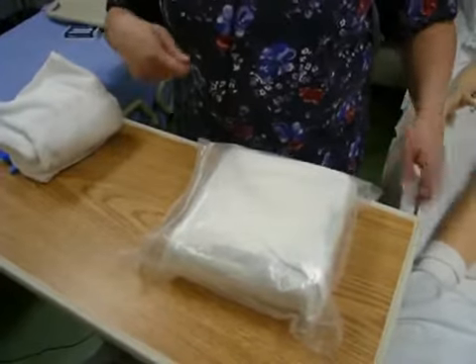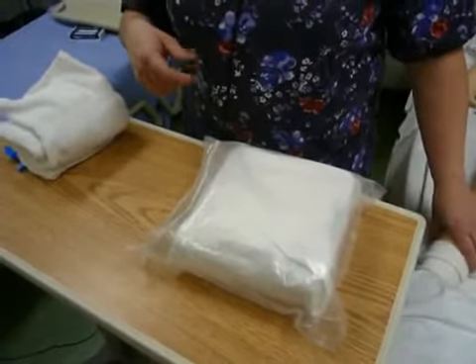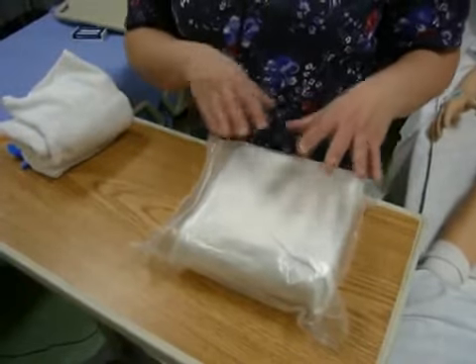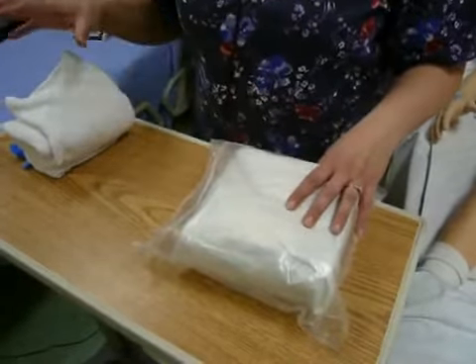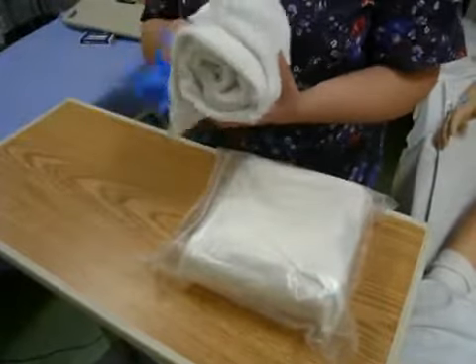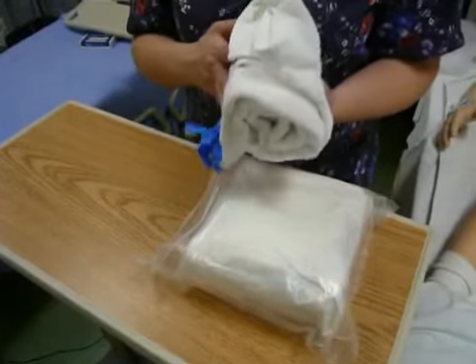He has his gown pulled up, the blankets pulled down, his legs are out at about a 45-degree angle from each hip, and then I make sure I have my supplies. I have my Foley catheter kit. I have a towel with a washcloth and a clean pair of gloves so that when I'm all done putting in the catheter, I can clean them up.